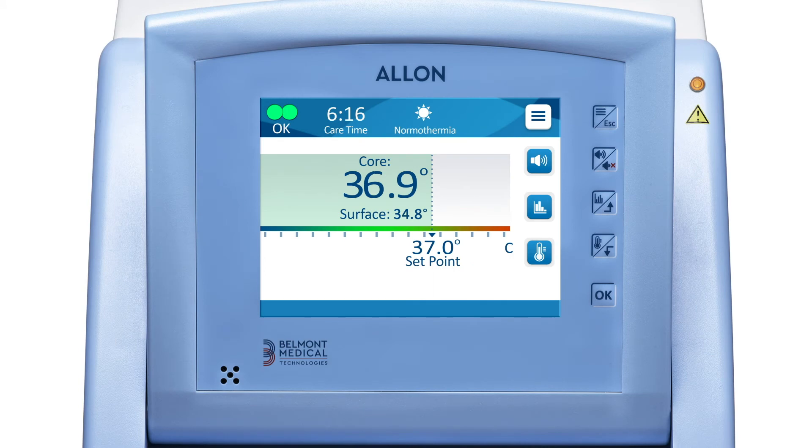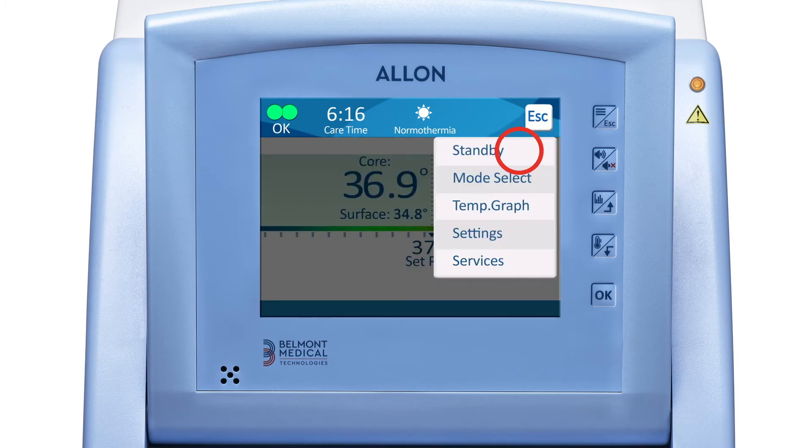If you wish to temporarily stop thermal regulation or water flow, put Alon into standby mode by pressing menu and then standby.